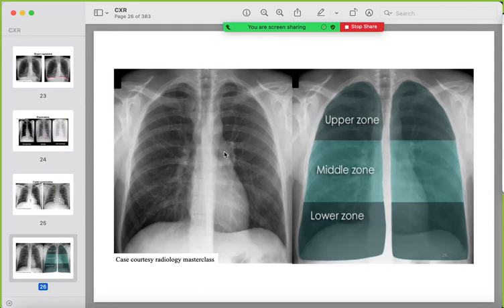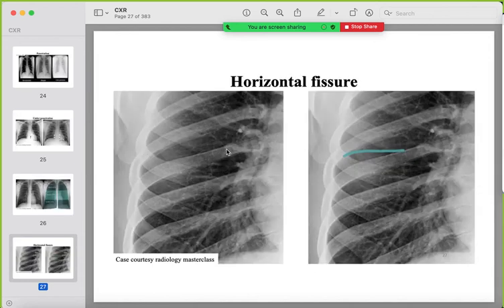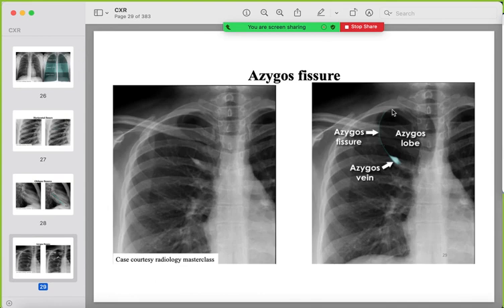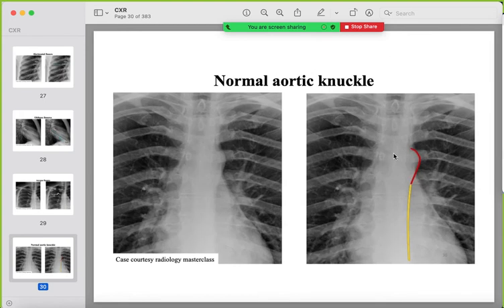On plain radiograph we refer to upper, middle, or lower zones rather than lobes, because fissures are not always sharply visible. The horizontal fissure is visible on the right; oblique fissures are seen on the lateral view. A normal variant is the azygos fissure creating an azygos loop — do not confuse it with pathology. You should also train your eye on the aortic knuckle's soft tissue density and shape, and the descending aorta.